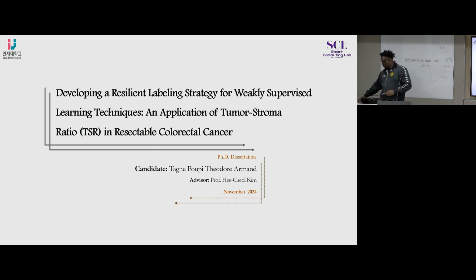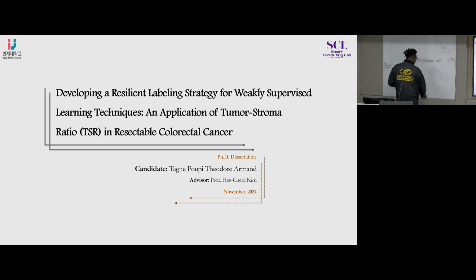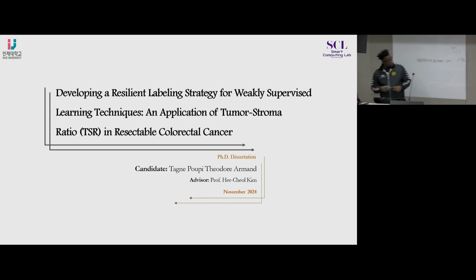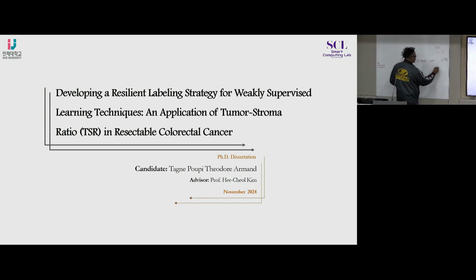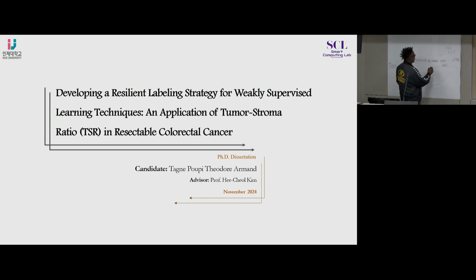So the new paradigm is like this. This is how we came across this problem. We used whole slide images before. In a simple way, what you do in the laboratory now, most people use patch images, very small images, to train their models. But now there are whole slide images, very big. They exist in digital pathology and also in geospatial images. You remember Google Maps, as you zoom, it gives more detail, and the Google image is the same.